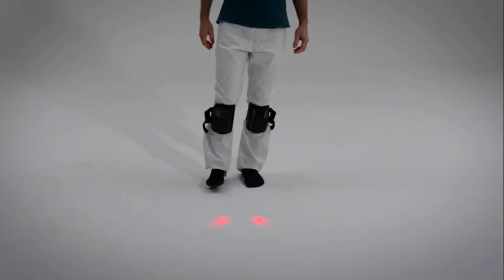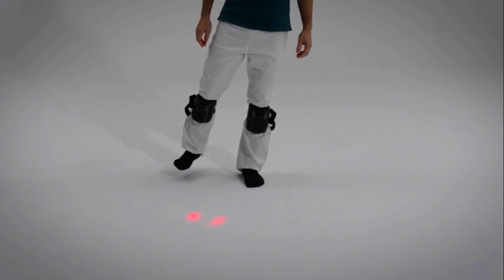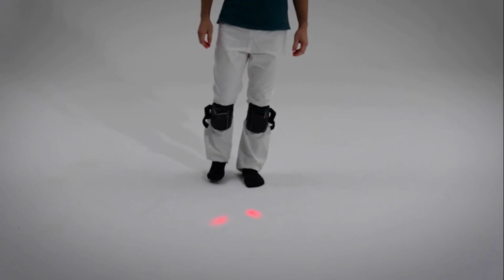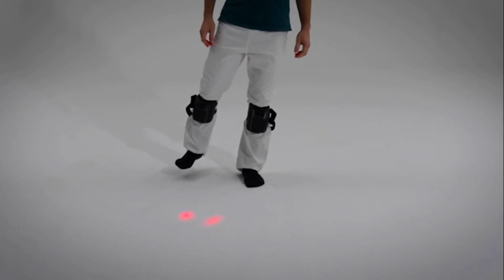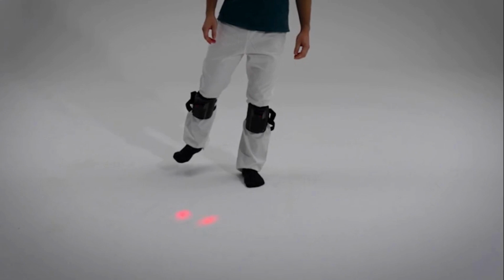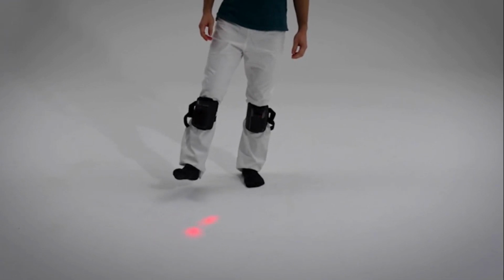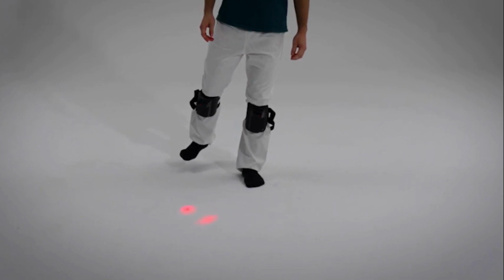Dual tasking. It is possible to use cue walk to generate a double task required of the patient in order to work on programming and motor control, such as balance associated with movement. In this case, the patient is required to keep the visual feedback fixed to the ground, generated by the limb in support, and with the other limb perform circumduction movements.